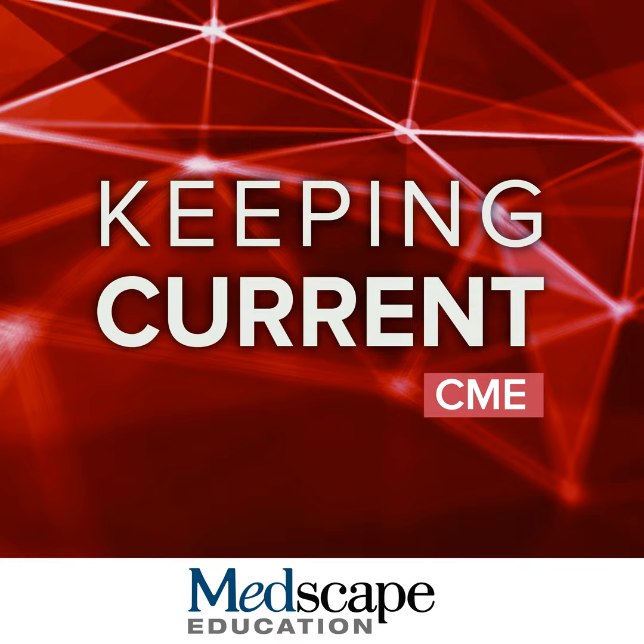And then, of course, the next step would be a PET scan. And really, which type of PET scan you would get is going to depend upon those specific symptoms and scenario that the patient is coming with. So if it's somebody that has very early impairment and the neurologist thinks that it is probably an Alzheimer type pathology and that they might be eligible for therapy, the imaging test we would want to do, specific to Alzheimer's disease, would be an amyloid PET.